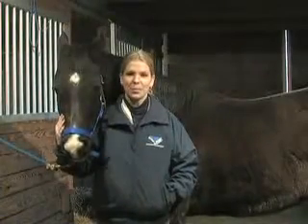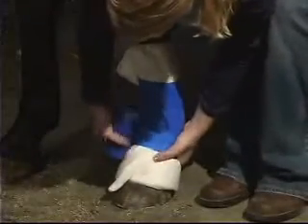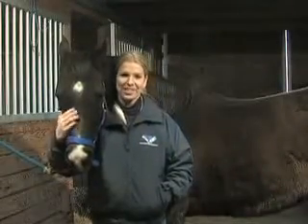Before applying the Dynasplint System, please speak with your sales consultant about adding a wrap underneath the splint. Wrapping is not always necessary, but since each horse is unique, wrapping can sometimes prevent further complications.